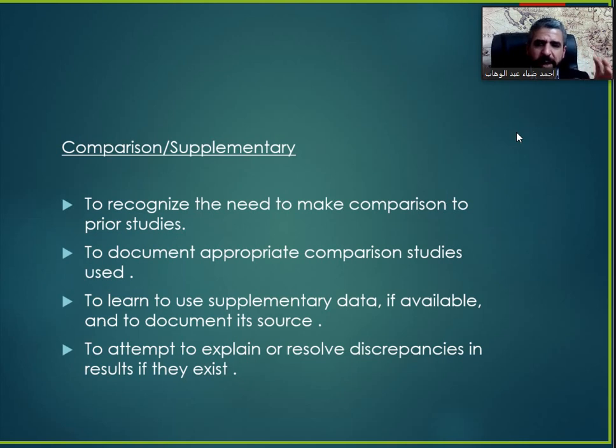In case of comparison or supplementary studies, we should write them to recognize the need to make comparison to the prior studies, to document appropriate comparison studies used, and to learn to use the supplementary data if available, and to document its source. From where do we have this supplementary data? And to attempt to explain or resolve discrepancies in the result, if they exist. If there is a difference in the results, why is that difference? We should try to explain it.